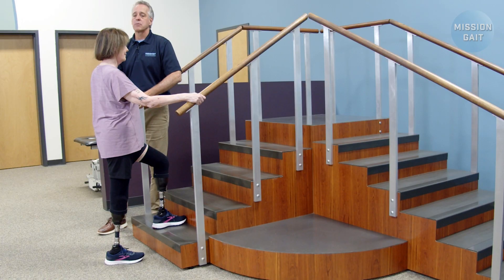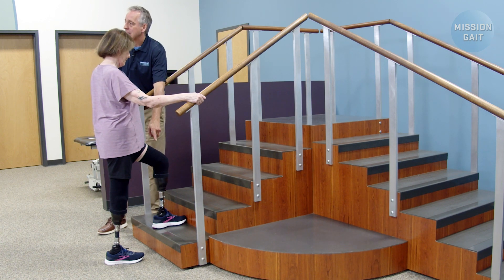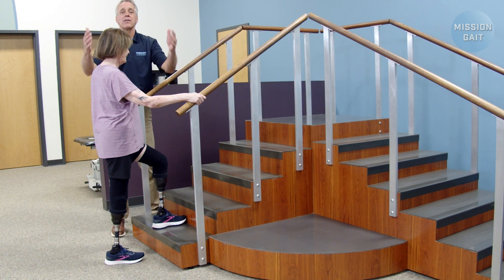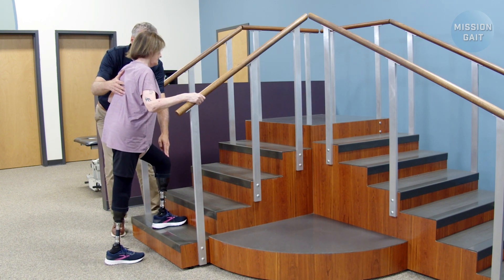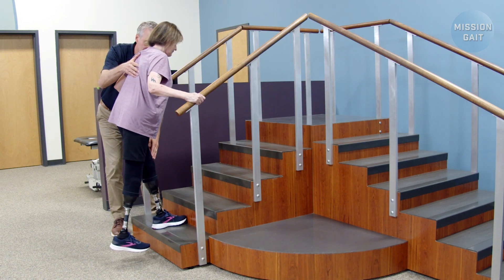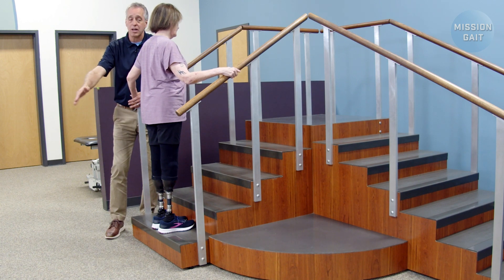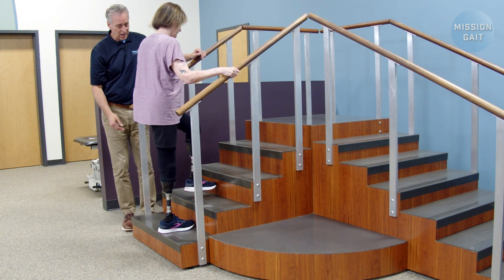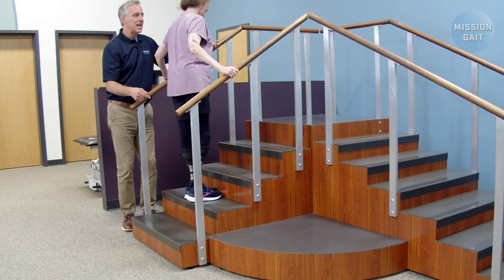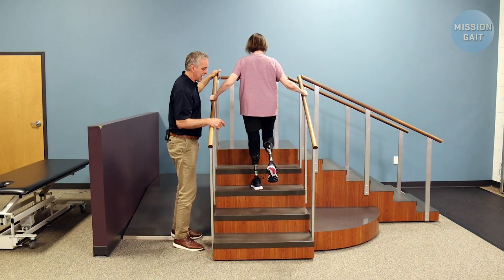Which foot? I always tell her just put a foot up — whichever one you feel better about, that's the right one to put up. So you'll naturally kind of go forward. The key mistake people make here is they try to lift themselves up. The key with Stephanie is she's going to want to lean forward and just straighten her knee, lean forward and straighten her knee, and then bring the other foot up. She lifted out to the back to not drag the toe on the step and trip herself. Don't have to kick out quite that exaggerated — just up a little bit to make sure the toe doesn't drag.